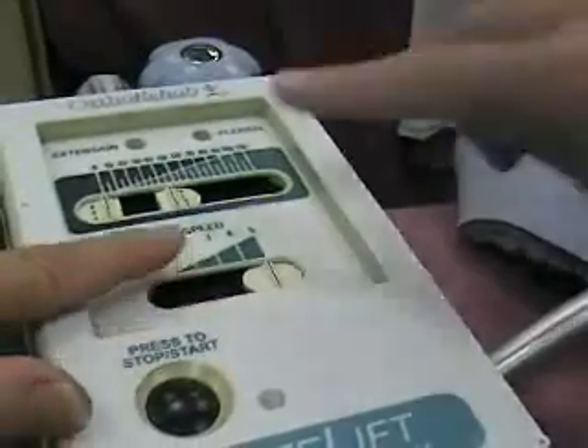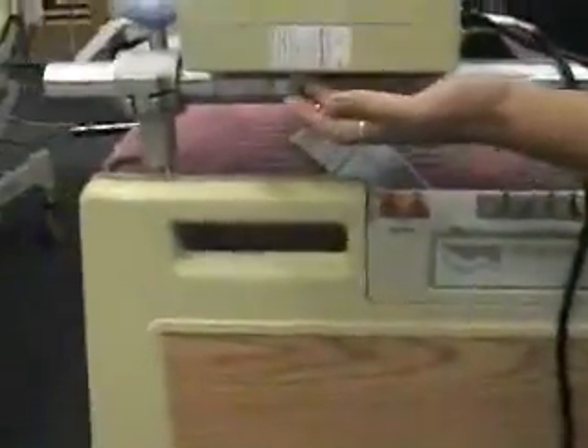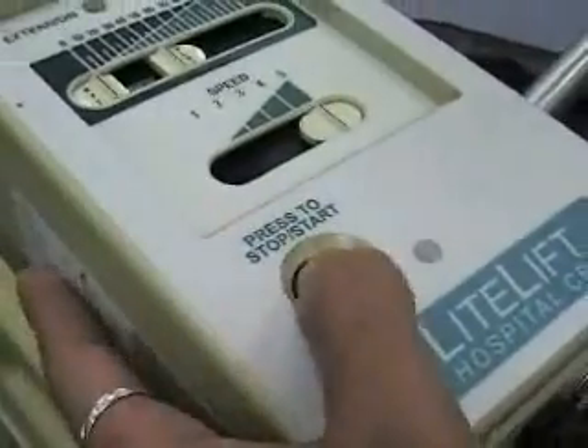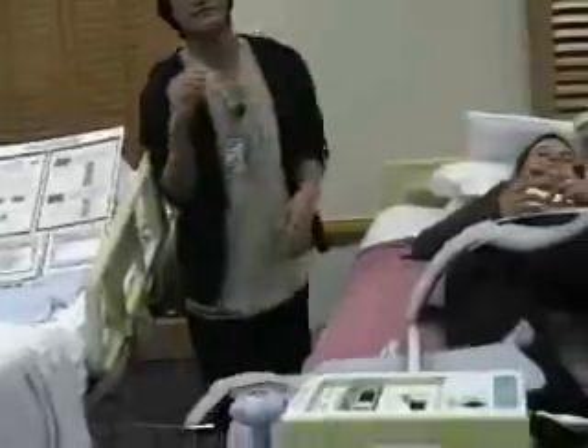Lauren is going to turn it on. You can change the settings box for speed or degree of flexion, but we always ask PT first if it's okay. Also note there's an on/off button right underneath here. When you turn it on and it's not responding, check that button first. And always make sure your equipment is plugged in — we just learned that lesson.